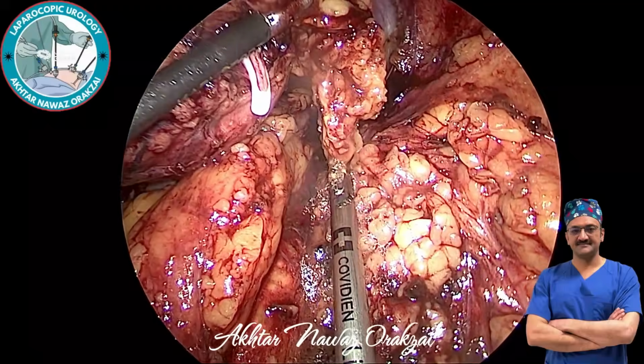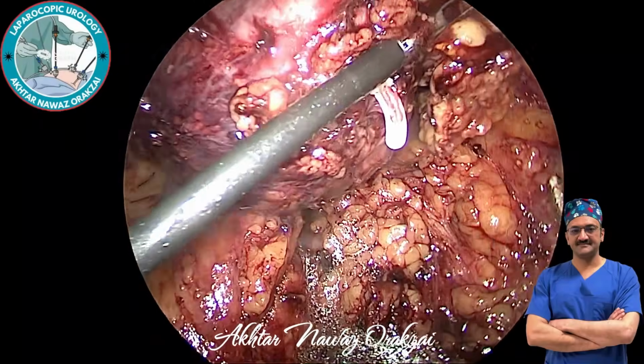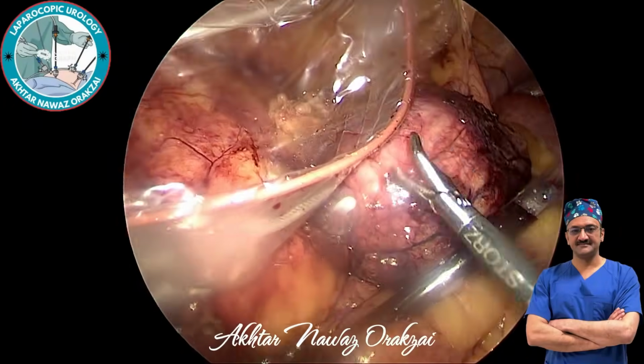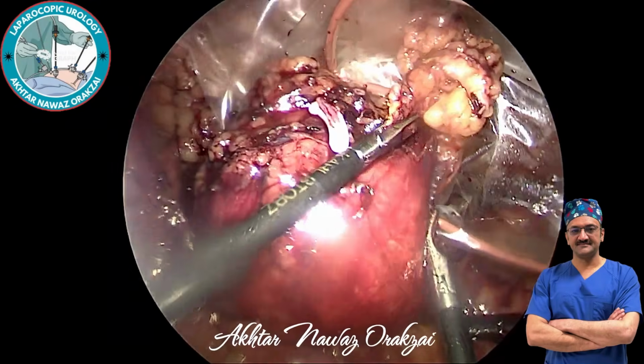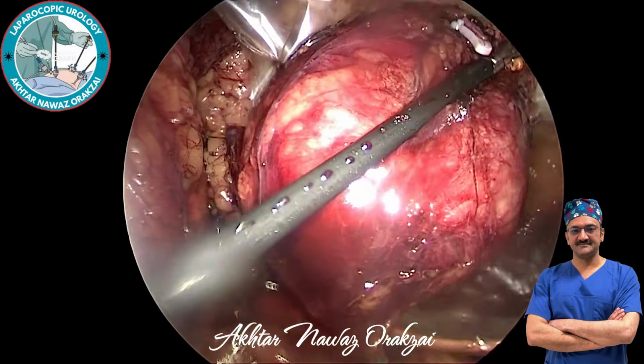So the procedure is performed quite nicely. All the field is very clear, there is no bleed, and we place this specimen into the retrieval bag and then we retrieve it.